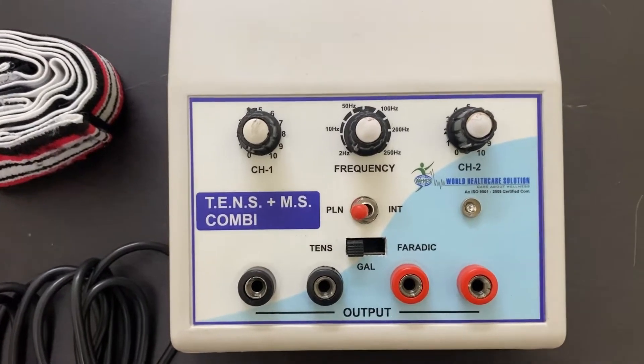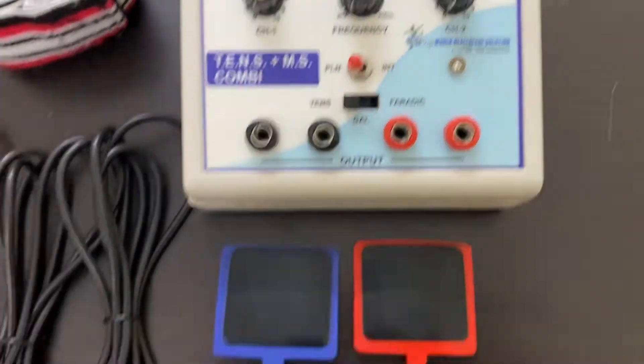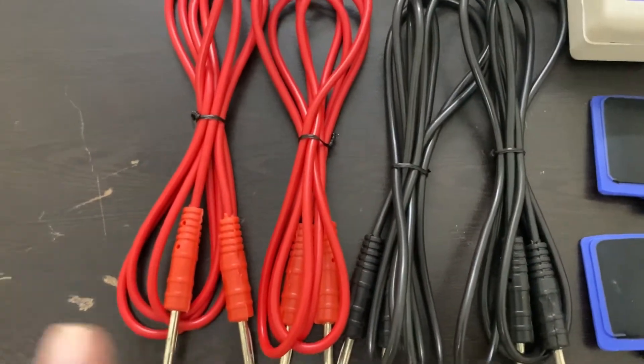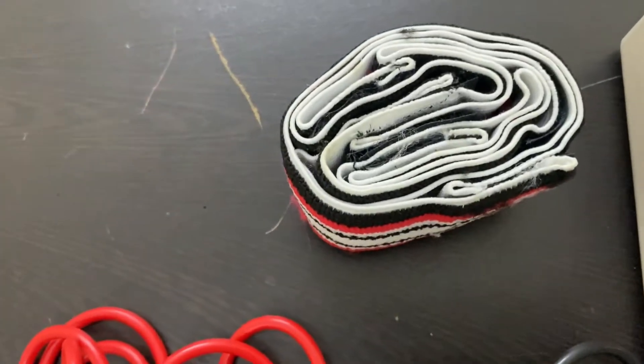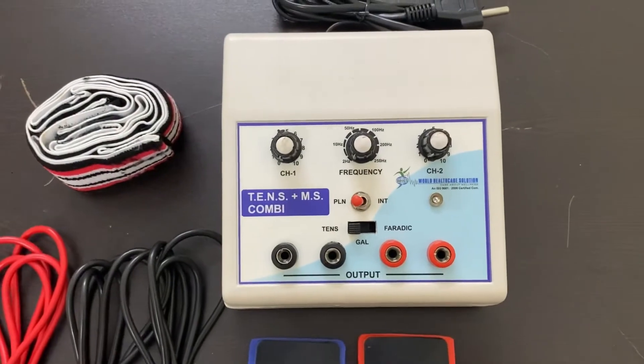First, let me tell you what you will get with the machine. With the machine you will get four electrodes, four leads — two red and two black — and one set of velcro which includes three pairs.